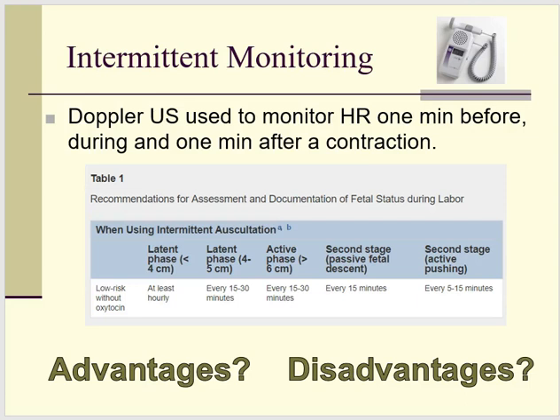Evidence-based studies started being done with long-term research about 10 years ago and found something fairly surprising. In several large-scale randomized controlled studies, they found no difference in fetal outcome when we used continuous electronic fetal heart rate monitoring. There was a significant increase in C-sections, but there was no corresponding decrease in fetal cerebral palsy or brain damage or any of the long-term consequences of hypoxia. This makes us pause, think about our evidence-based medicine, and realize that it's a little bit more complicated maybe than we first realized.